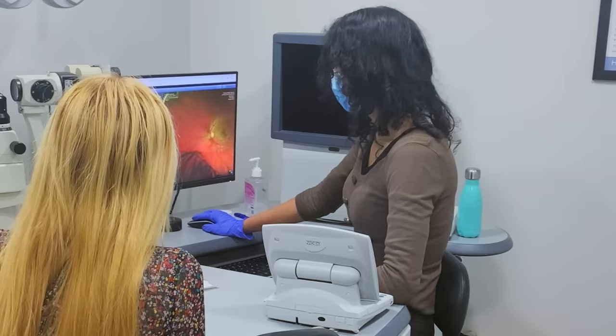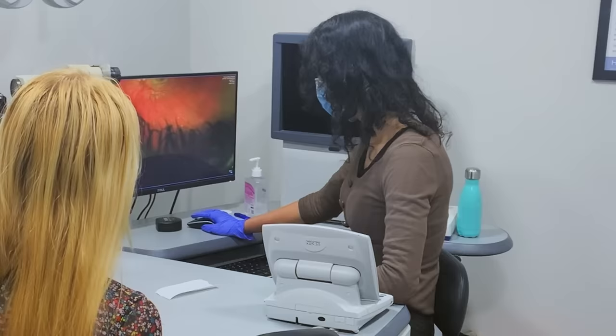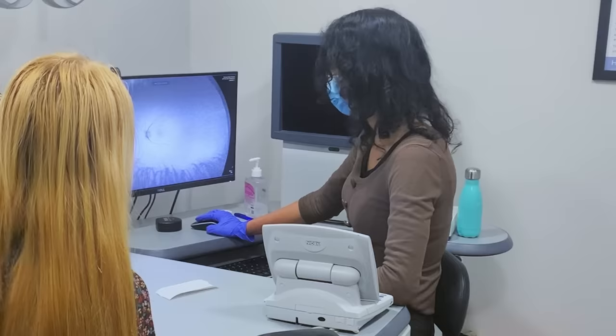Excellent. And the left eye looks like a mirror image. Okay, good. Lovely. So again, your retina looks great, perfectly flat and healthy. And again, your blood vessels look perfectly healthy, as does the nerve. Now just have a look at the black and white view. Good, so that looks brilliant as well. Perfectly uniform, no concerns there at all.